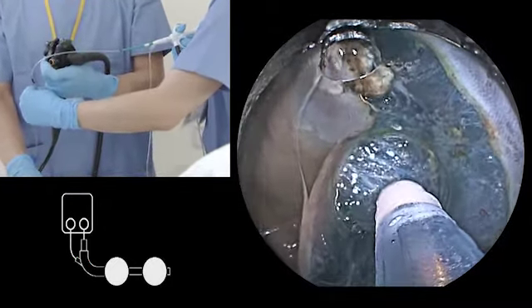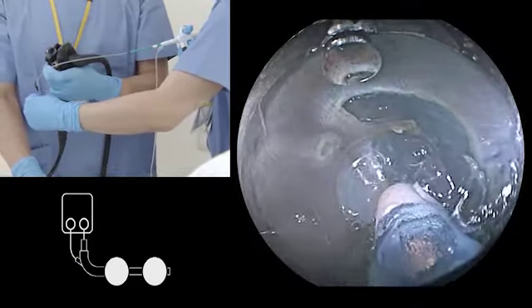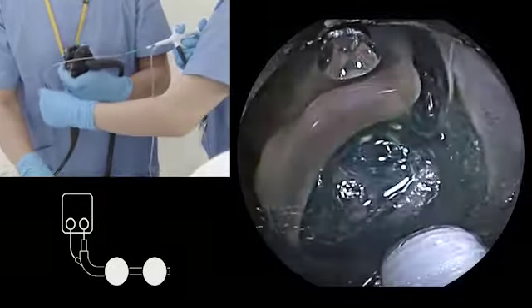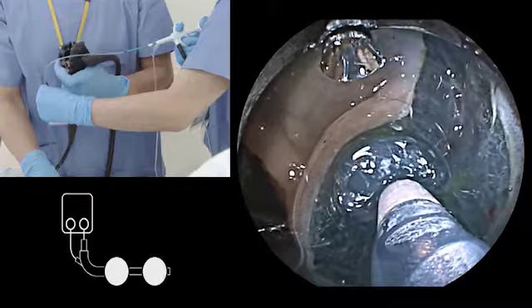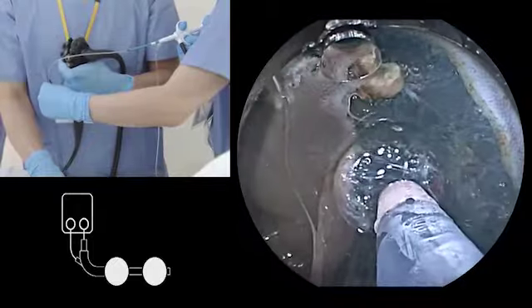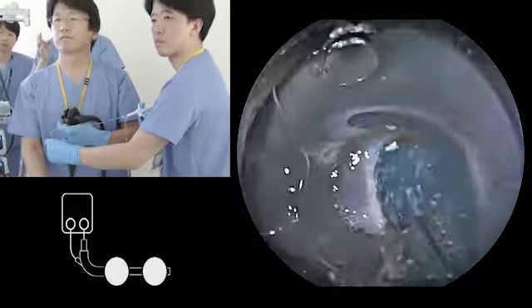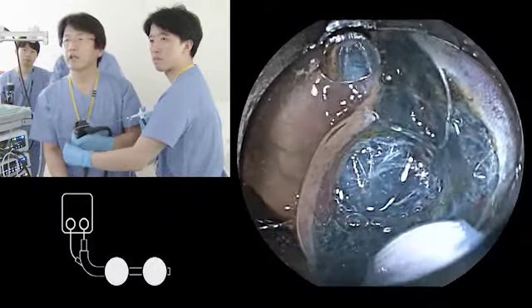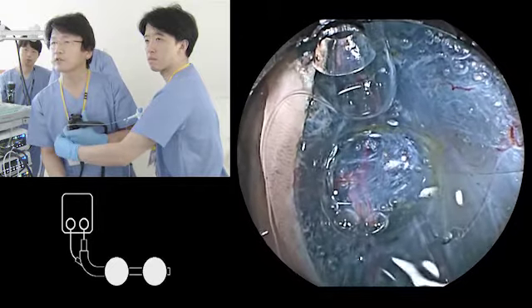But I have to be careful because this region was on the fold, so maybe the muscle layer is right in front of you. You have to have a good orientation all the time. Even if you can't see the muscle layer, you should have a good orientation and you have to guess. Now the muscle layer is located right-hand side, and then Dr. Yamamoto nicely cut the submucosal layer from the downside to the upside. Yes, then I can push down to the muscle side, and then I can see through the muscle.